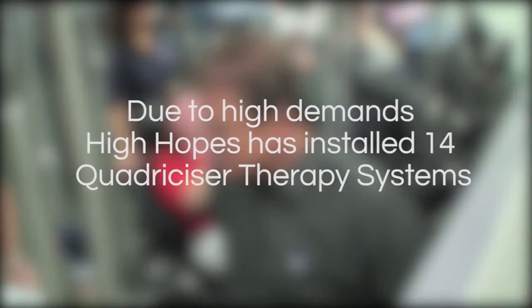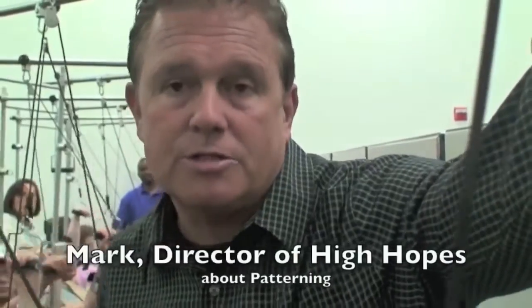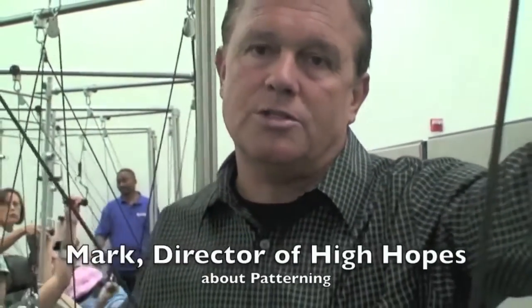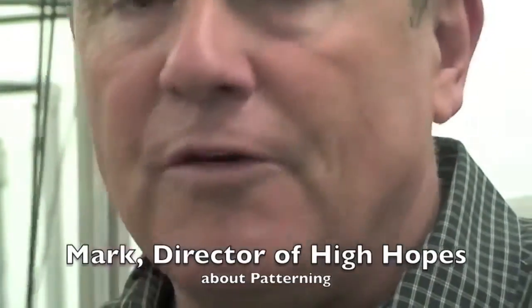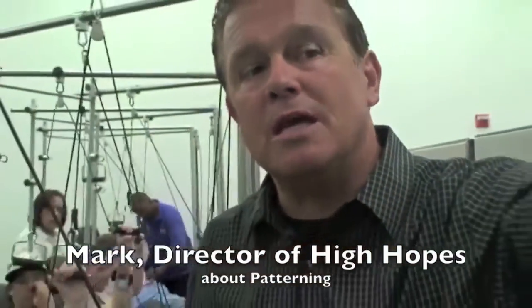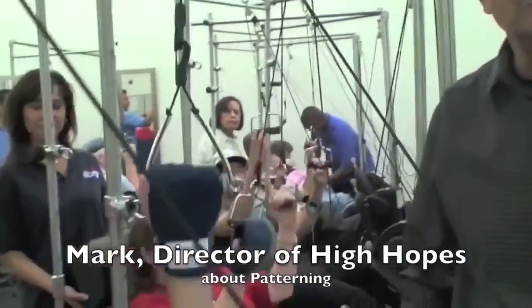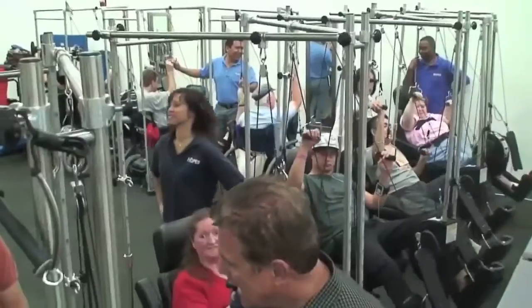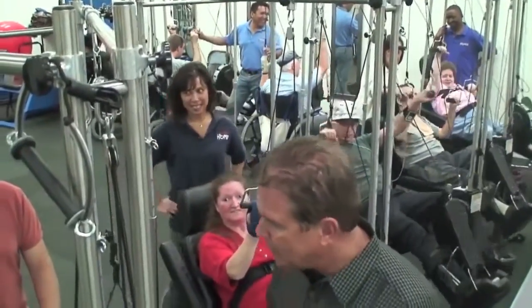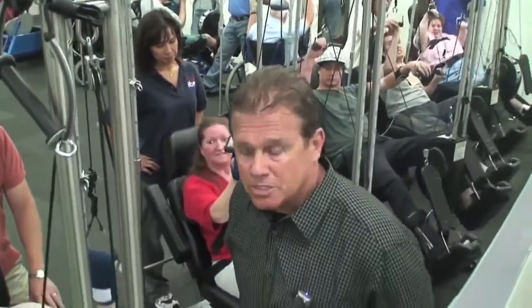My name is Mark Desmond. I'm director here at High Hopes — we're the first brain injury program in the United States, and we love these quadricizer machines. Patterning itself was invented in the 1950s and originally took five people to perform. This machine is able to do it on its own, so anywhere we can help more than one person at a time is phenomenal.